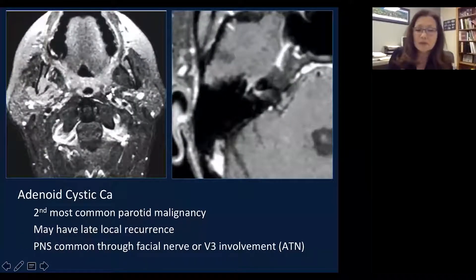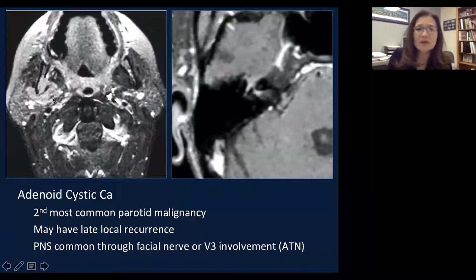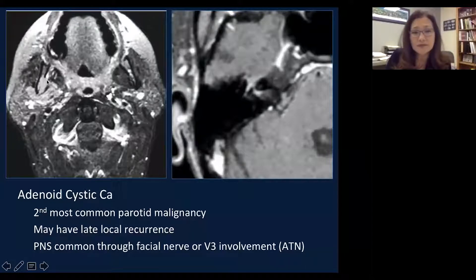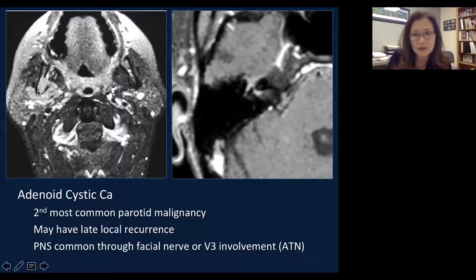The second most common parotid gland malignancy is adenoid cystic carcinoma. Notice the mass in the deep lobe of the parotid gland. It involves the mandible — notice the bone destruction of the inner cortex of the ascending ramus of the mandible — and the tumor invades directly into the bone. These are very aggressive imaging features, not seen in benign parotid gland tumors.